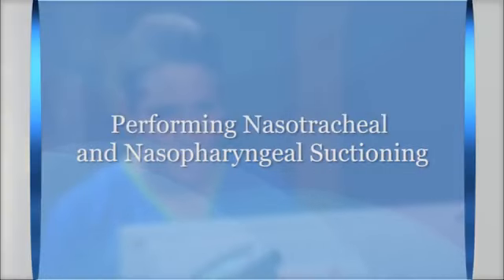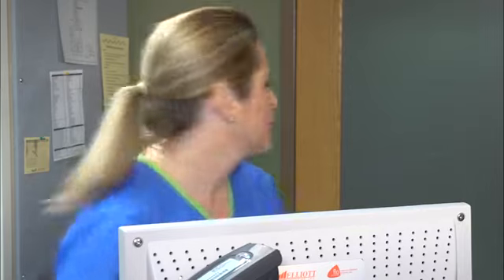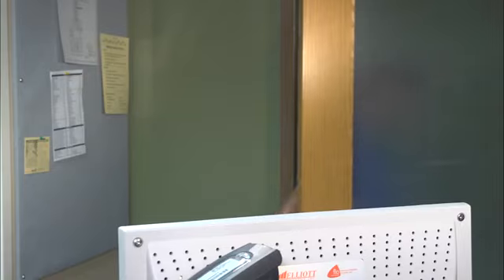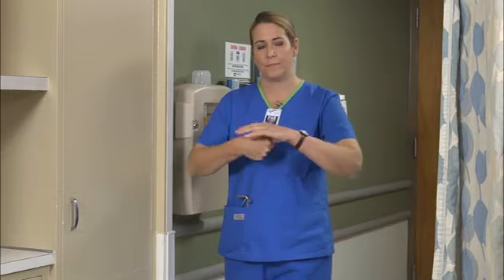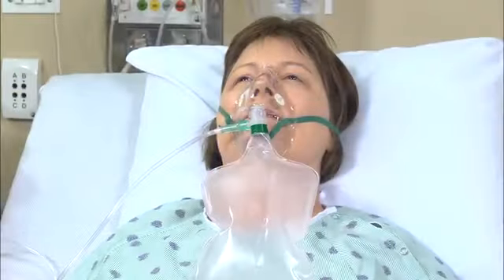Before performing nasotracheal suctioning, make sure the patient has no contraindications to the procedure, such as a bleeding disorder, epiglottitis, or laryngospasm. Perform hand hygiene, ensure privacy, and introduce yourself to the patient.